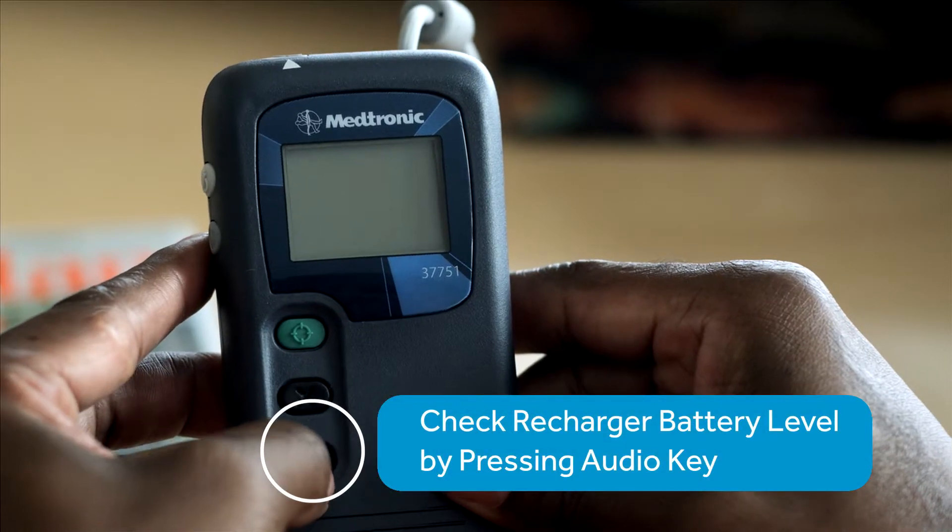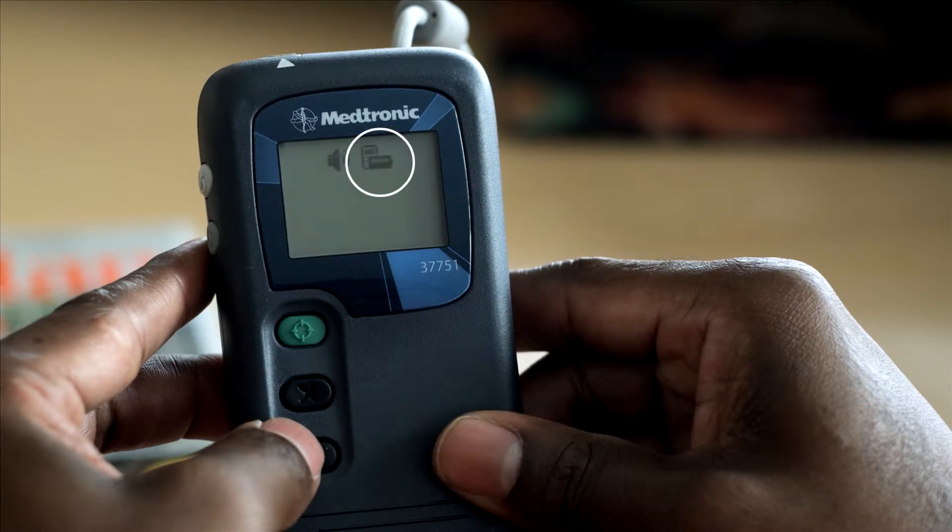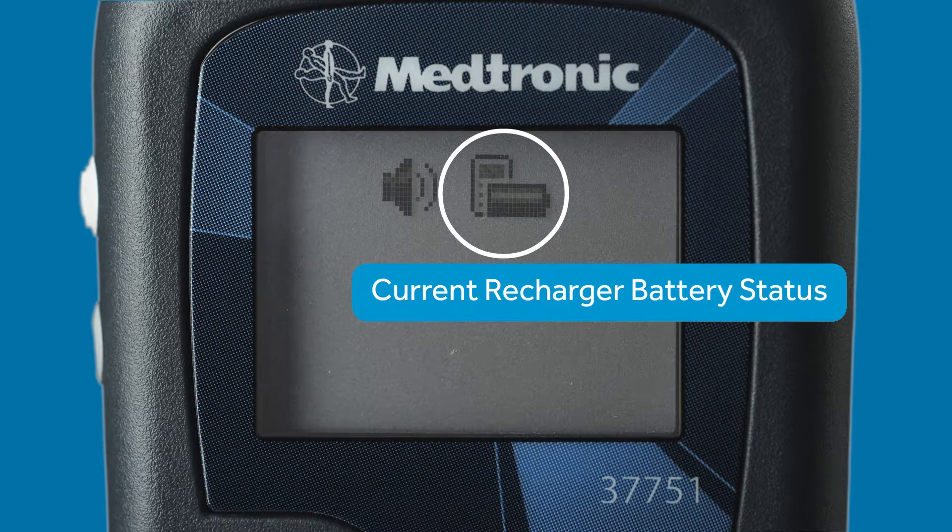With the recharger off, you can check its battery level by pressing the audio key. The recharger battery level icon is displayed here. It shows the current battery status.